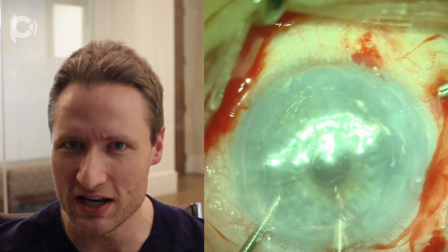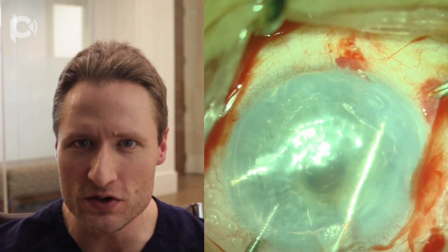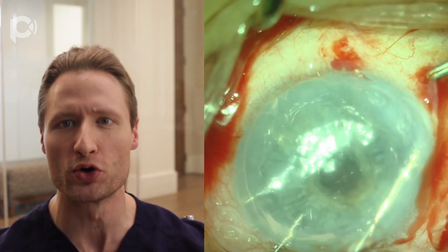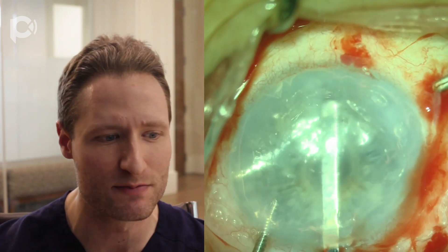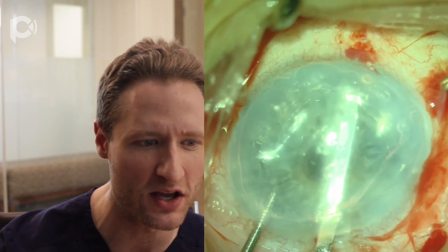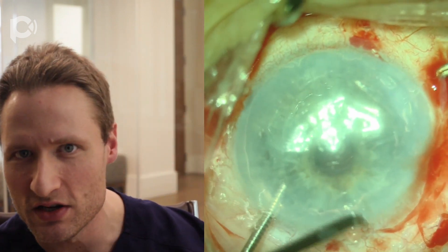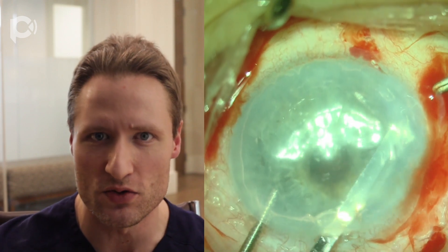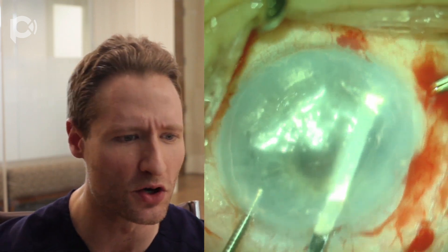I am extremely meticulous about stripping all of these scattered rests of Descemet's membrane and endothelium from the posterior corneal surface. The best way to make sure you're getting them all is to use air. You also want to pay special attention that you don't have unstripped remnants around the wounds, because they tend to get trapped in the wounds when trying to extract them. This is the longest part of the surgery — not the graft unfolding, but preparing the bed for putting the new endothelial cells into. That's the component of the operation that I spend the very most time doing, because I think that's the critical component.